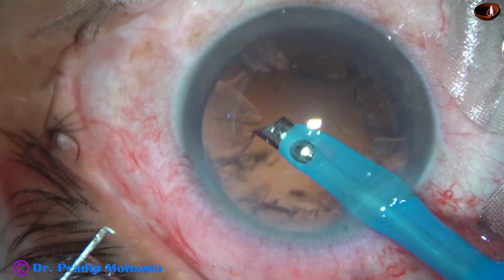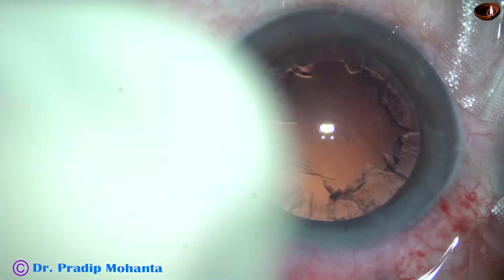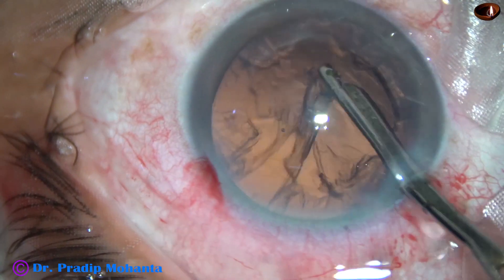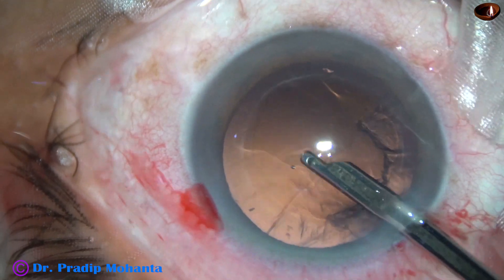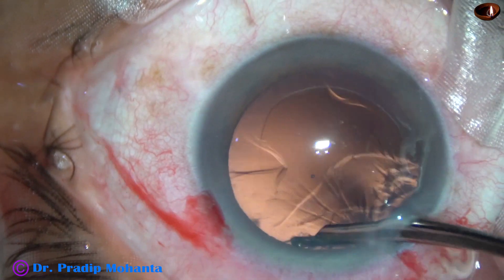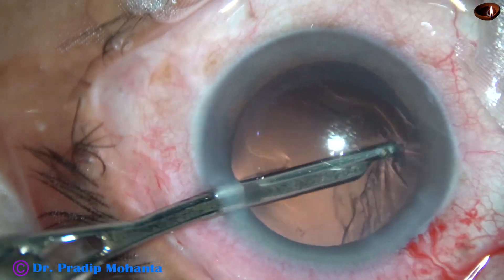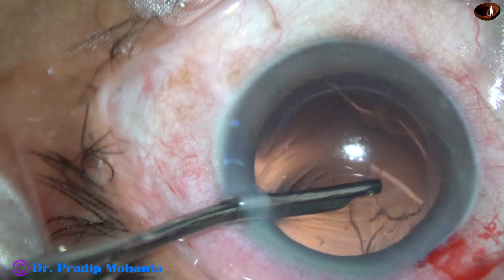I tried to remove the cortex with the FACO needle itself, but then I felt it may be dangerous and came out. This is the direction of your instinct — if your instinct says it is going to be dangerous, just don't do it. So I came out, and this is a 23-gauge Simcoe cannula — a very safe instrument. Very beautifully, we can remove the cortex with this instrument. It may take a few seconds more than bimanual IA or coaxial IA, but it is safer than the automated methods.